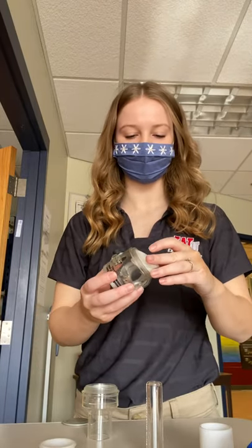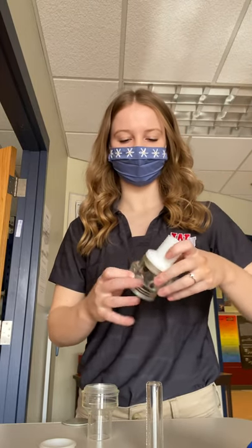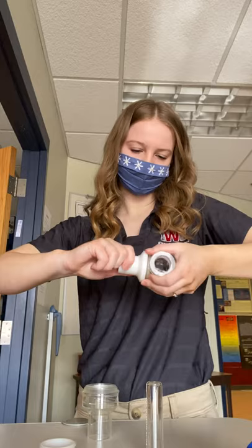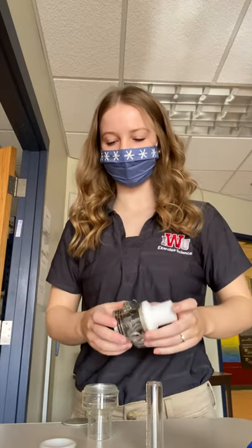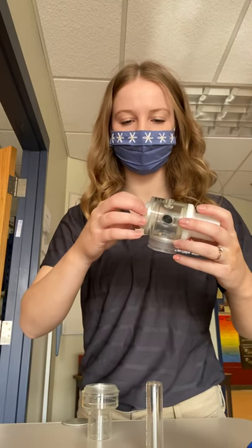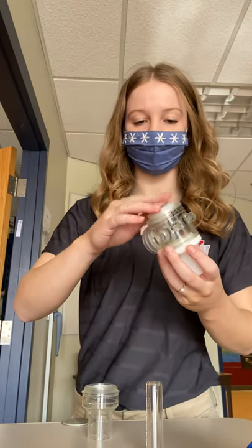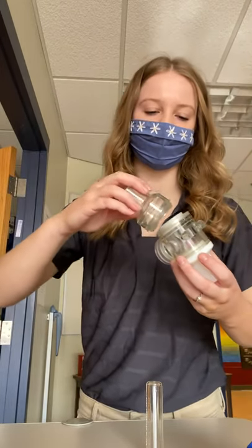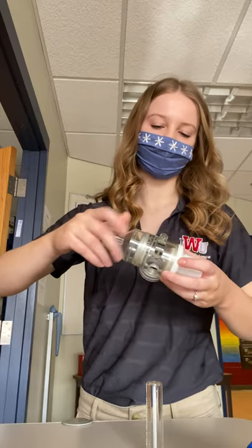You'll put your inspiratory side on with the valve facing this way. You'll put your other one in facing the same way — that's the expiratory valve, which is this one with the little triangle in the middle. You'll screw that on and make sure it's nice and tight.